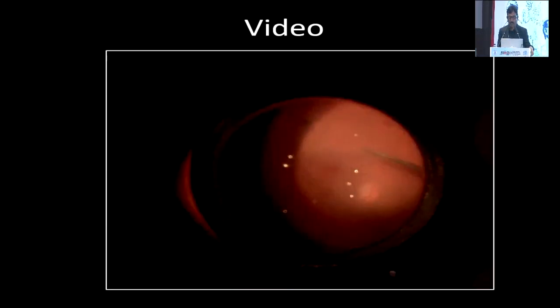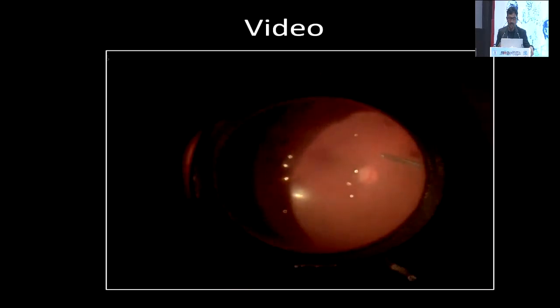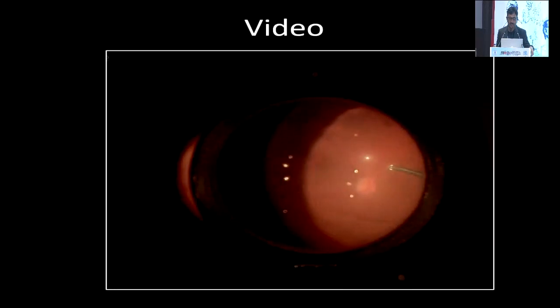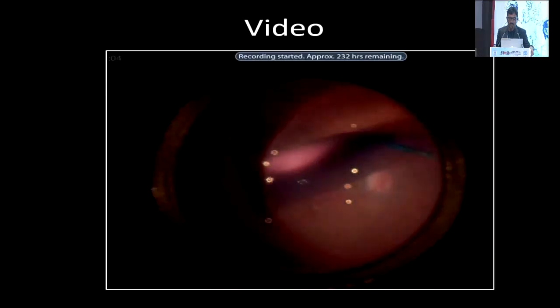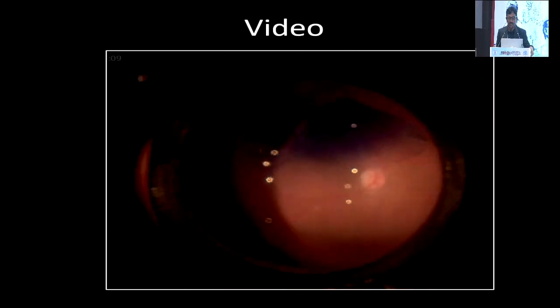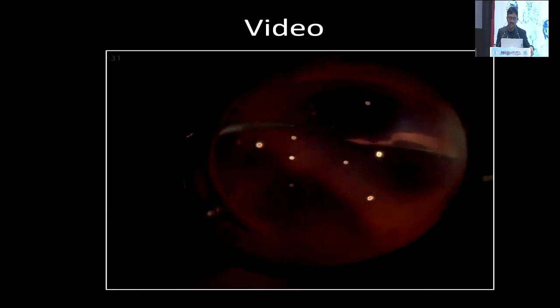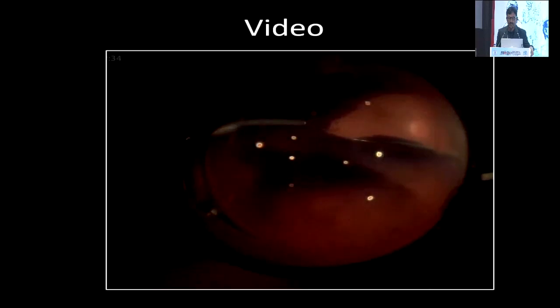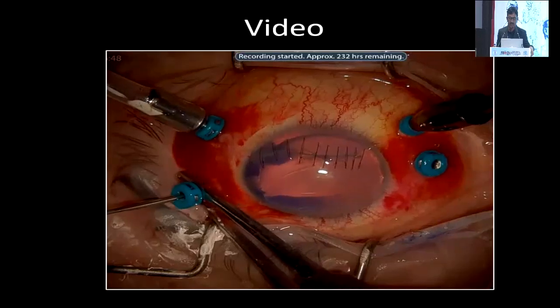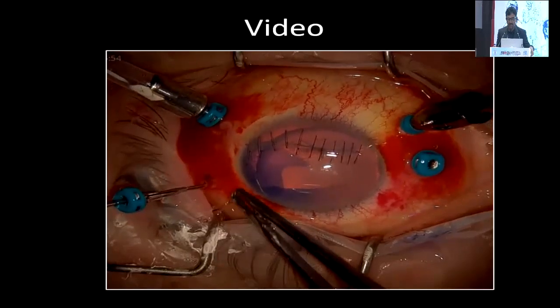Now the challenge is how to remove it in toto without leaving behind any pieces of the soft contact lens. It has gone through the inferior zonular deficiency which the patient had, at around 4 to 6 clock hours inferiorly. The best approach is to stain the contact lens. Even if you cut it into pieces, you can tear it bimanually and cut it with the cutter. Staining is the main key here, because staining allows you to see the fragments, even the small pieces of the soft contact lens left behind. So once you have done that, you can easily eat away at it with the cutter.